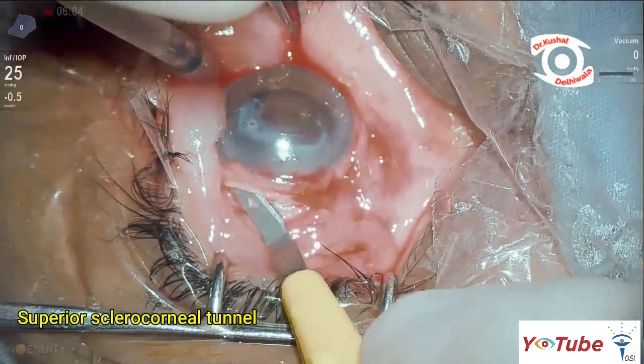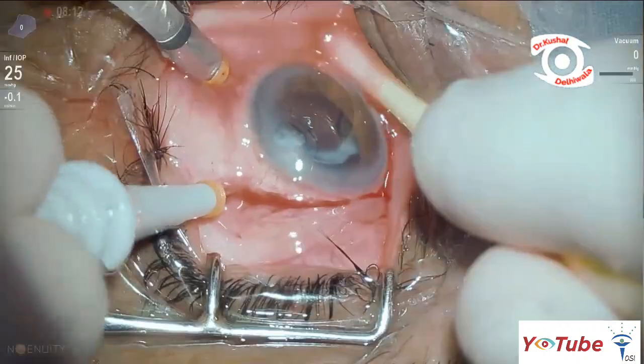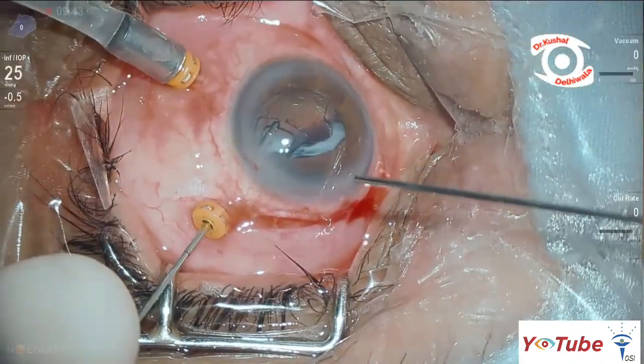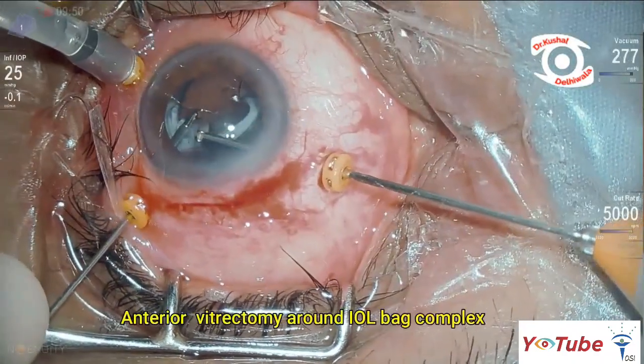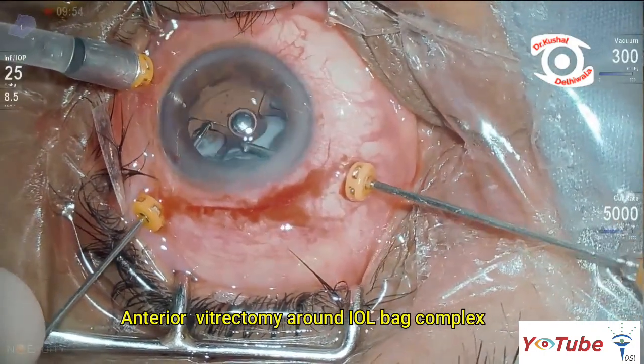A superior sclerocorneal tunnel was made with a crescent blade. Using a 23-gauge trocar cannula system, the IOL was steadied with forceps and the anterior vitreous was cleared around it.